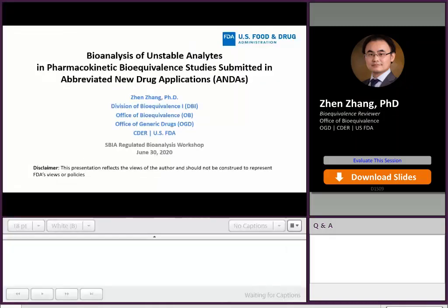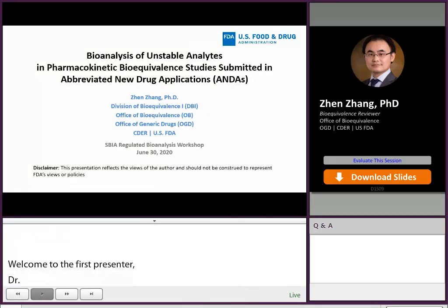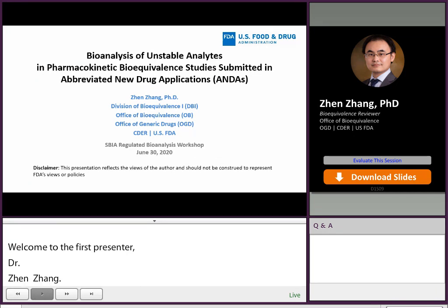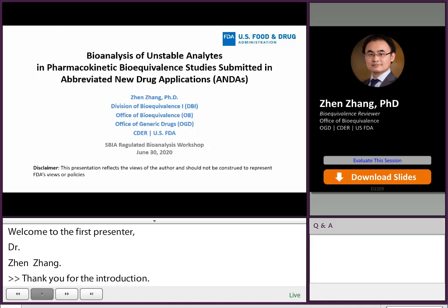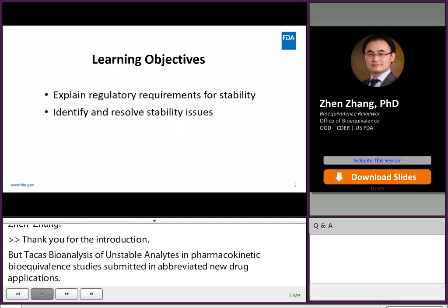For the introduction, my talk is the analysis of unstable analytes in PK/BE studies submitted in ANDAs. This presentation reflects my personal view and should not be construed to represent FDA's views or policies. The learning objectives of my talk are to explain regulatory requirements for stability and to identify and resolve stability issues.